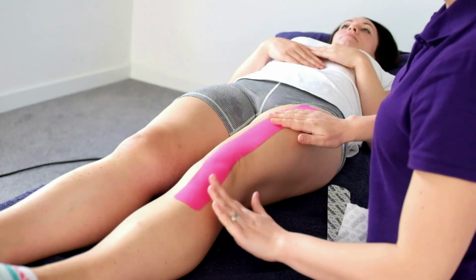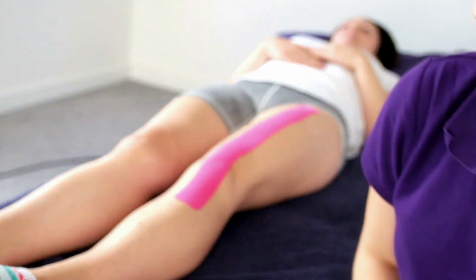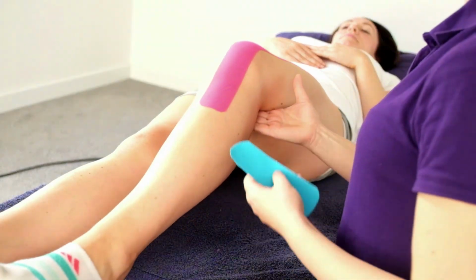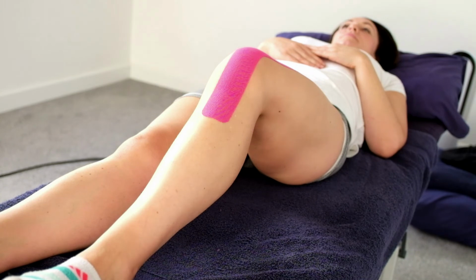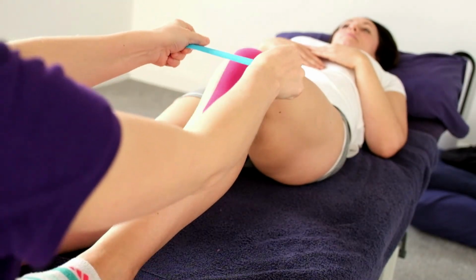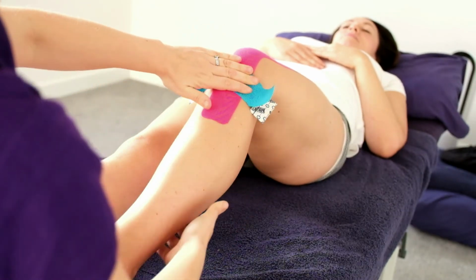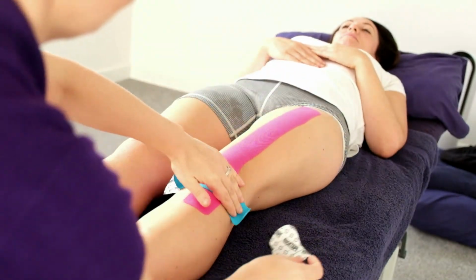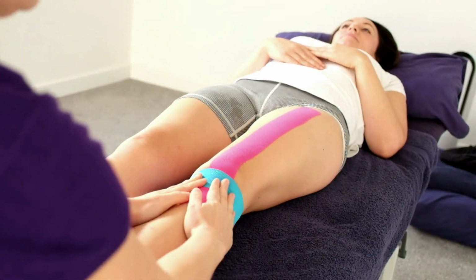We now move on to mechanical taping and tendon offload taping for the patella tendon. So we have a small amount of tape breaking off at the centre, stretch on the tissue by bending the knee up. And you want to create a heavy tension of the tape in the direction down towards the tibial tuberosity. Then we relax the knee, straightening the leg to apply the anchors on both sides, and then stick the tape down by giving it a rub.